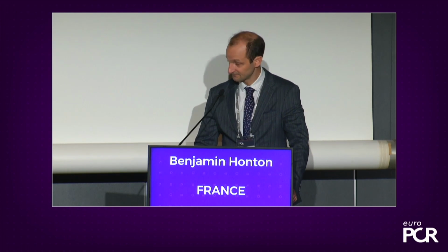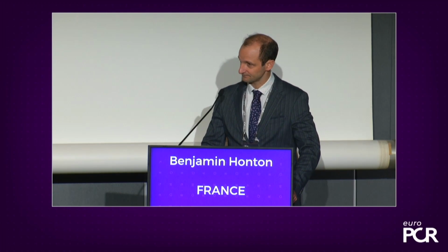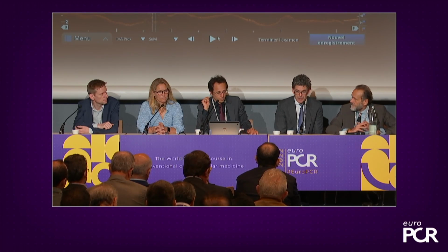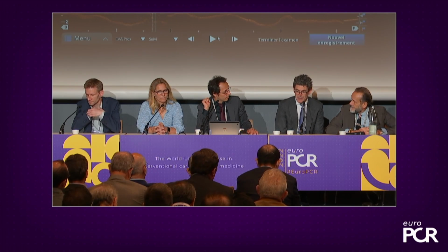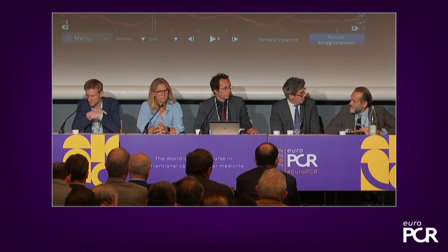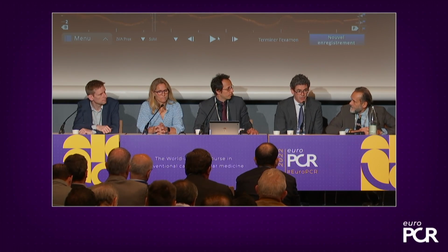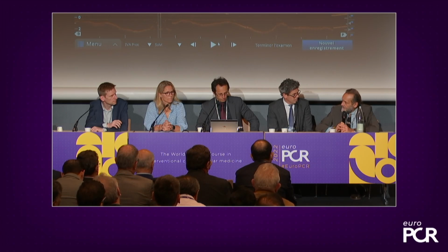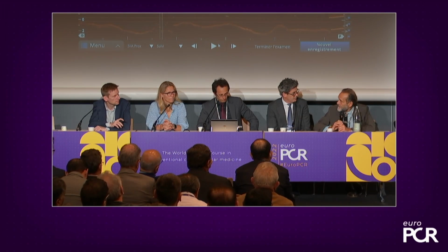Once you've achieved focal modification, there's a temptation to stop. But that really neglects the rest of the lesion where there is calcium along the whole length of the lesion. I agree with Benjamin, you should use all the shocks that are available for total lesion modification, and you place the balloon in other segments. Absolutely, so share out the shocks along the length of the lesion. It's better to use all the runs available.